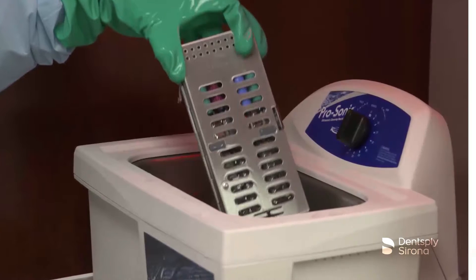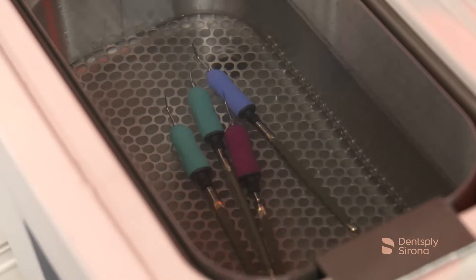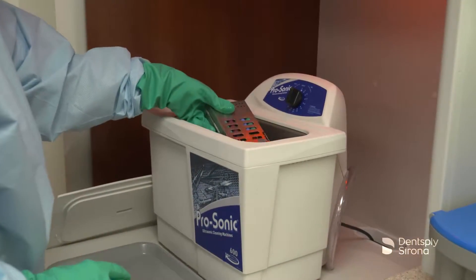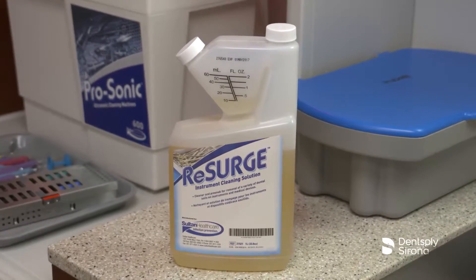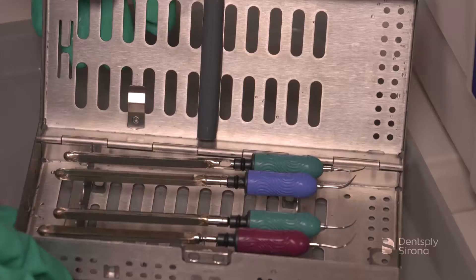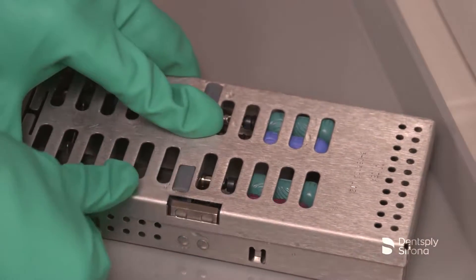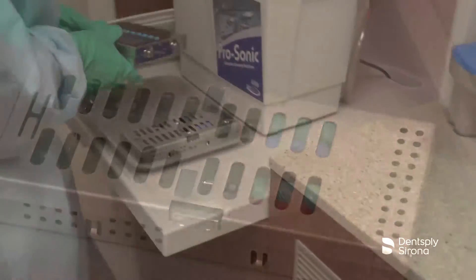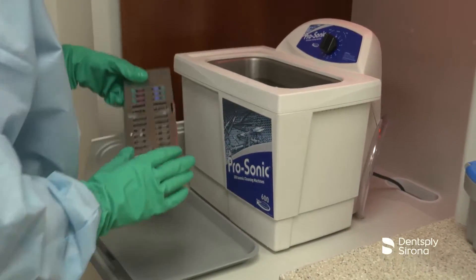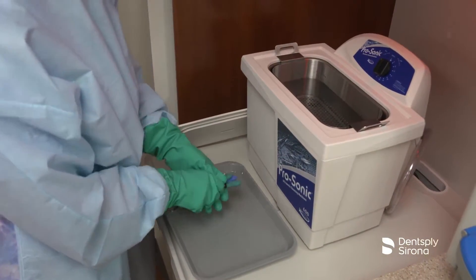Automated cleaners increase the efficiency of the cleaning process and reduce the handling of sharp instruments. It is important to follow manufacturer's instructions for instrument cleaning solutions, carefully observing the concentration rates and contact times. A pH neutral instrument cleaning solution, such as Resurge, may be used for up to 15 minutes in an ultrasonic bath. When placing Cavitron inserts into an ultrasonic bath, the use of an instrument cassette is recommended to reduce the risk of insert damage. Utilizing a cassette for all instruments protects instruments from damage and minimizes the clinician's exposure time to soiled, loose instruments. If cassettes are not an option, place the instruments into a basket.